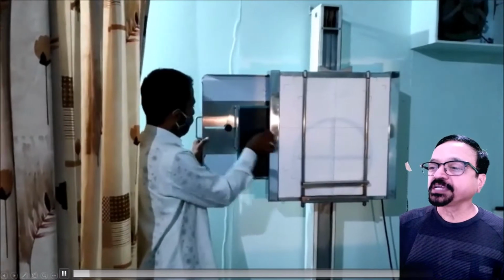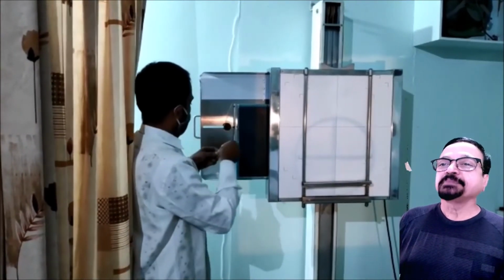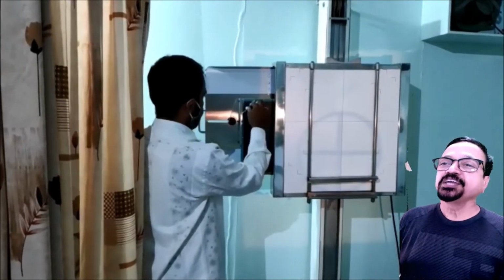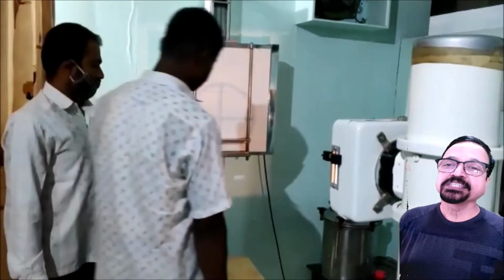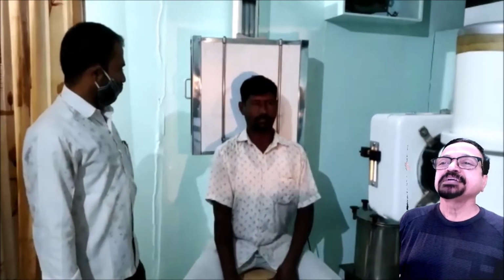Instruction to the patient should be given clearly because it needs hyperextension. And if the patient cannot give hyperextension, you will have to go for the tube angulation. So it is a technically really difficult X-ray. Let's see how it is taken and whatever is described about the patient's position. First the patient is sitting, then the patient has to hyperextend the neck.